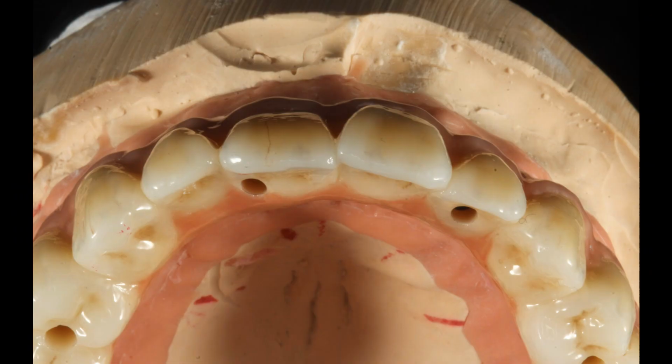I mentioned the slight interruption in perfection, and this is just demonstrated here. This tooth and this tooth are just ever so slightly further out than the others. And you'll notice again the translucency that's built into the teeth by layering porcelain, and even this craze line.